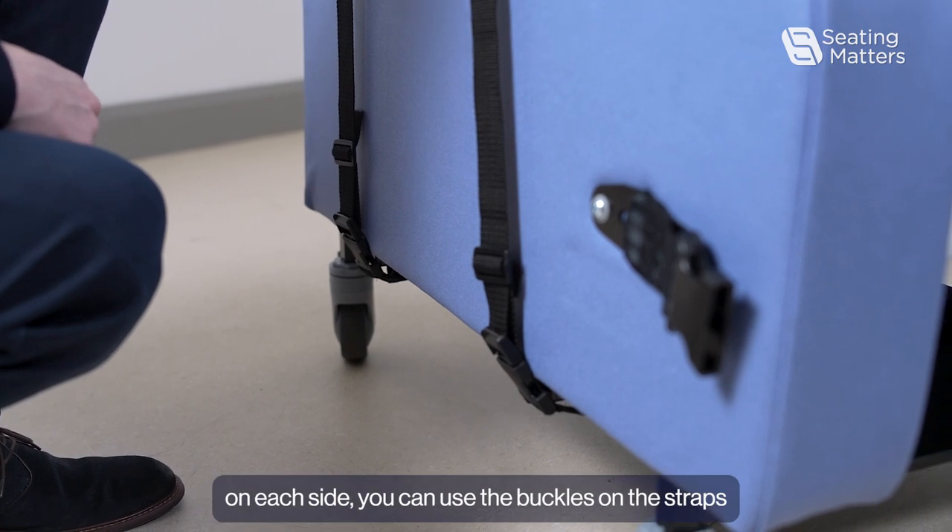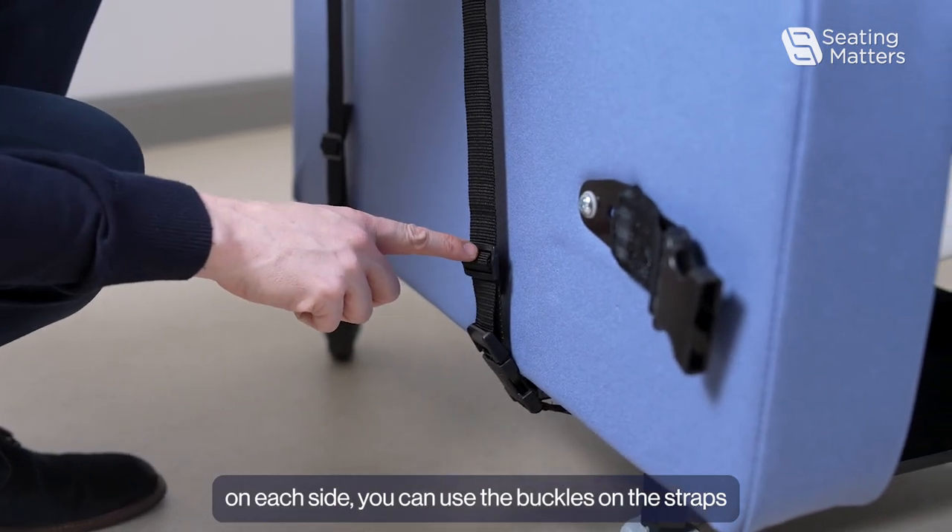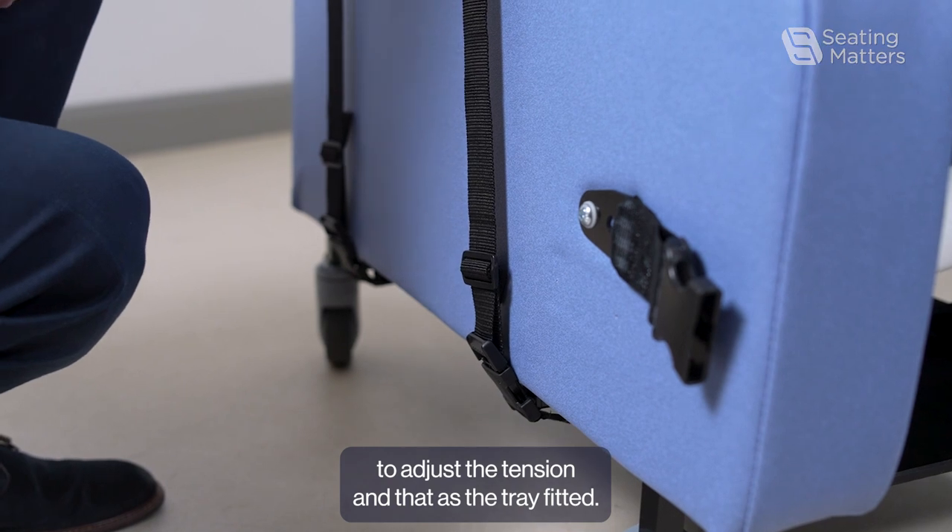Once you have done that on each side, you can use the buckles on the straps to adjust the tension, and that is the tray fitted.